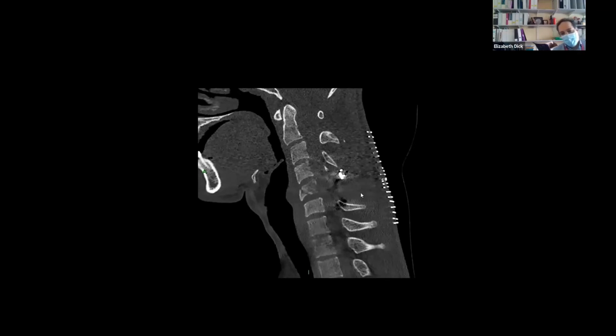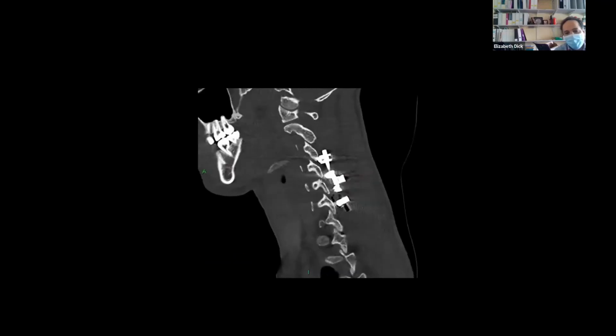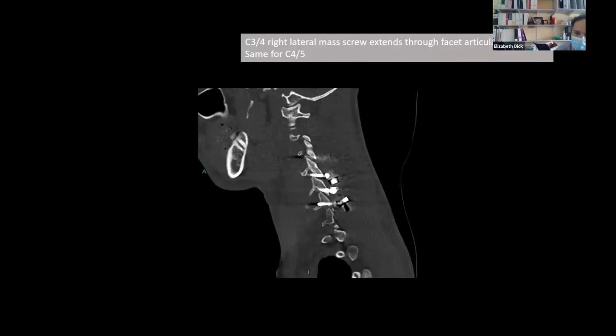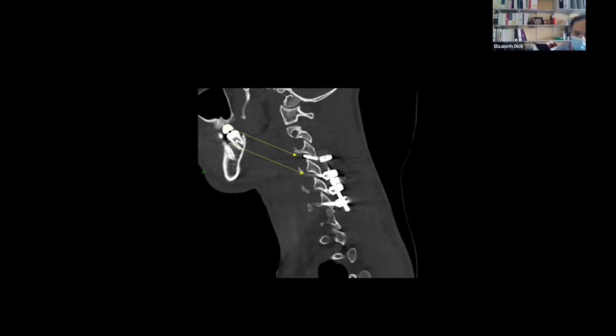And of course, then the metalwork. And the metalwork in this instance, because it's in the subaxial cervical spine, there isn't an awful lot of room in the pedicles. With the exception of a few of our colleagues, especially in countries like Japan, who tend to put pedicle screws in the cervical spine, the vast majority of surgeons internationally would use the lateral masses, because the lateral mass is a great chunk of bone which you can put screws in. And so this is lateral mass fixation of the subaxial spine from C3 to C6.